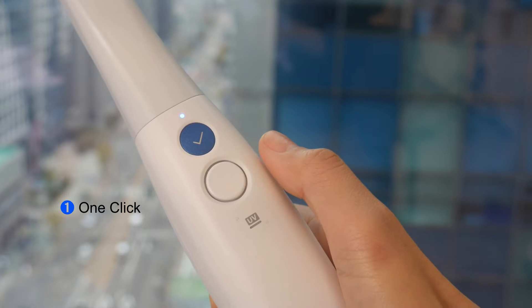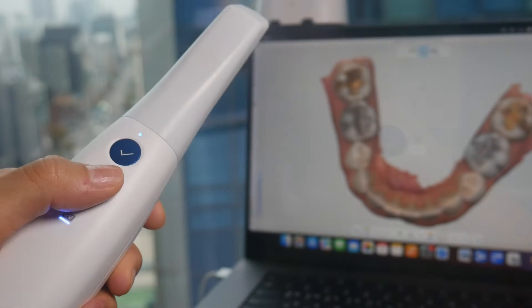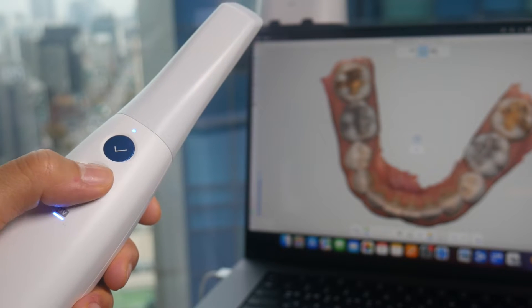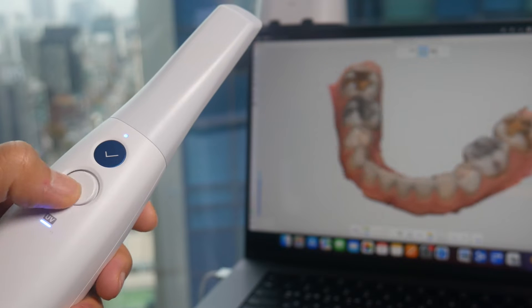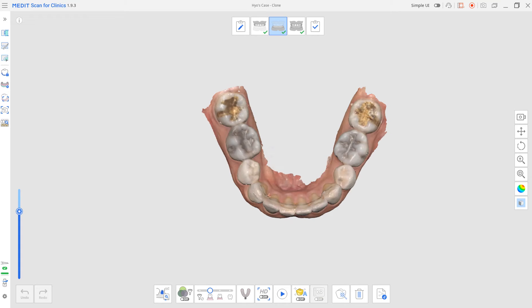First, data control mode. Control your scan data with one or two clicks. With a single click on the center of the control button, you can select modes such as rotate, pan, and zoom in or out as shown on the screen. You can use the control button to choose each mode and control scanned data.